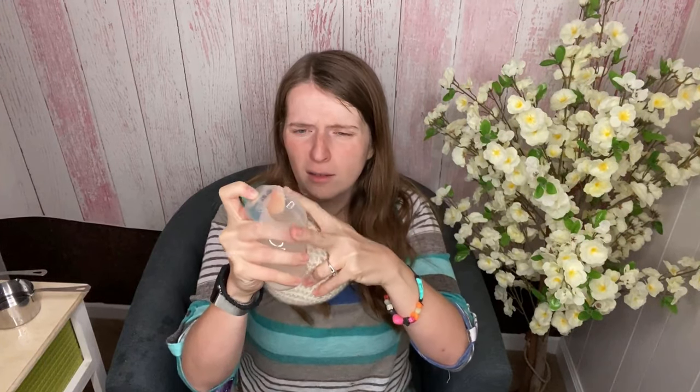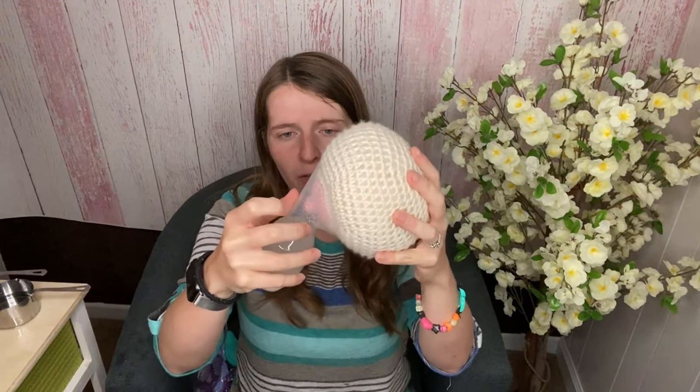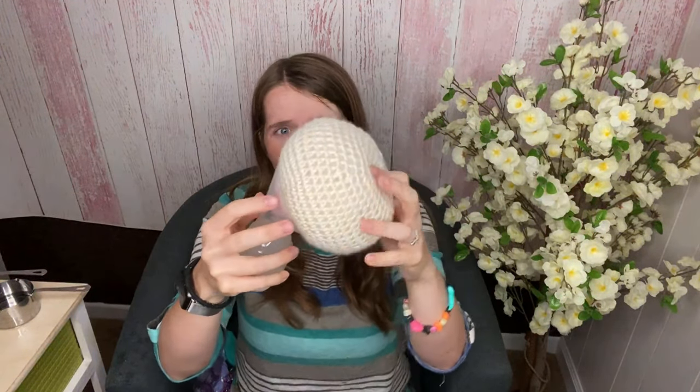Once you've mixed together that solution, you're going to attach it to your breast. Pull back the flange like this and then attach it until it suctions. Then leave it on for about 10 to 15 minutes, and you can combine it with massage for even more success.